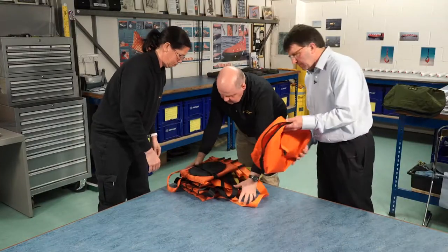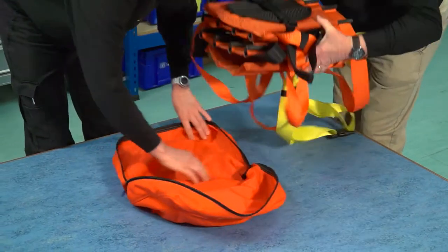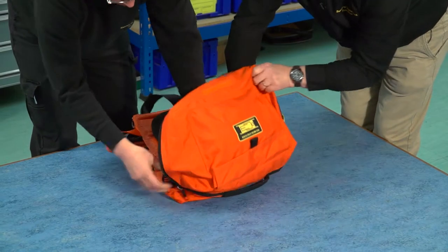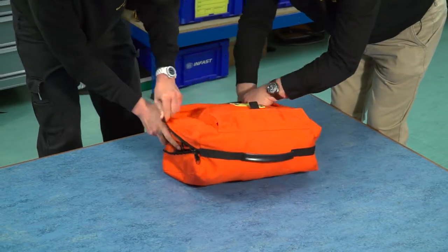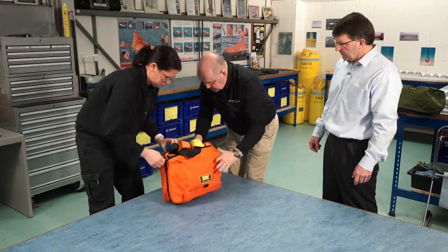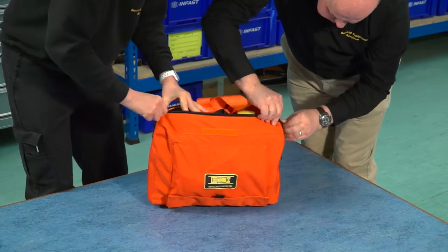Although obviously putting the stretcher away takes a little longer than deploying it, presumably that doesn't really matter because when you're putting it away you're probably back at HQ — it's not an emergency situation. That's correct, so we can take a bit of time. There's no real rush; we're doing it fairly quickly just to demonstrate that it doesn't take an awful amount of time.